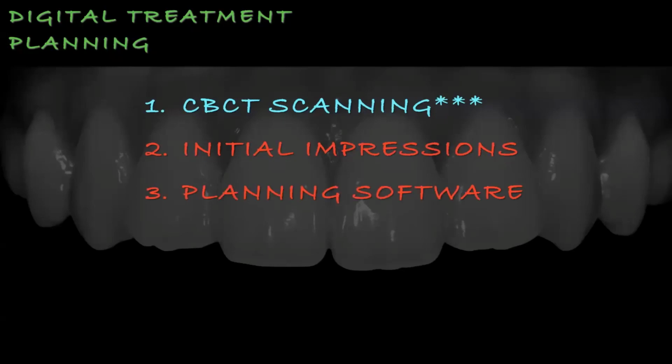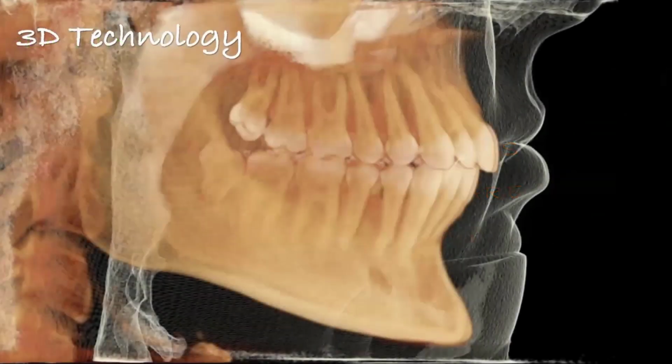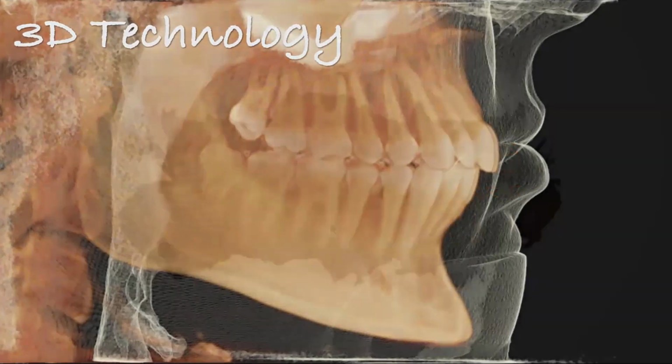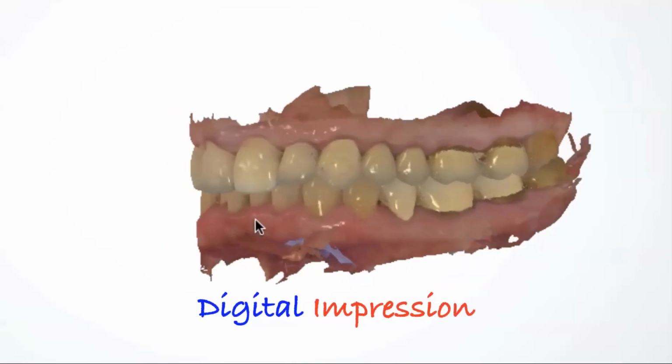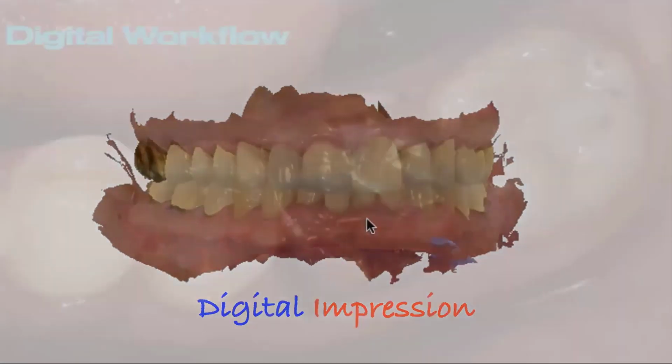You need a planning software that will allow you to amalgamate those two. There's lots of softwares out there. DTX Studio is a good one, but we also have the software that comes on the actual machines. It really helps as well, which a lot of times can be DTX. And then you talk about guided surgery, which we'll talk about at the very last section of this lecture, just to see if that makes some sense for us to do on a routine basis. So we take our 3D technology, we take an iOS scan. It could be a regular impression too. We could snap some alginates, and we put them in the workflow.